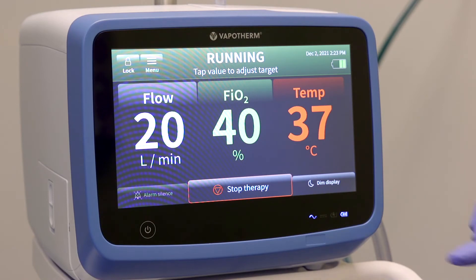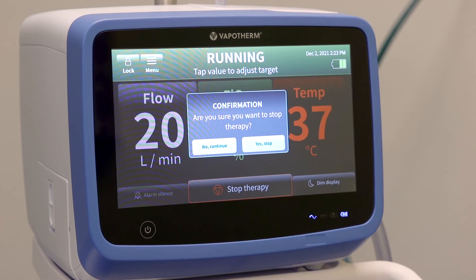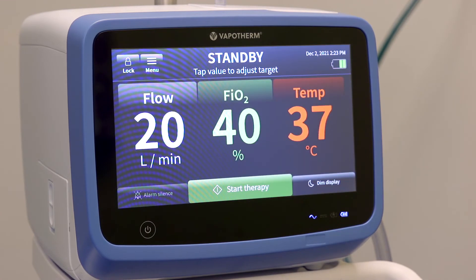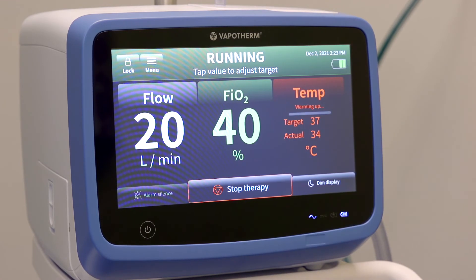To pause therapy for any reason, tap the stop therapy button at the bottom of the screen and follow the on-screen prompts to confirm stopping therapy. To resume therapy, simply tap the start button again.